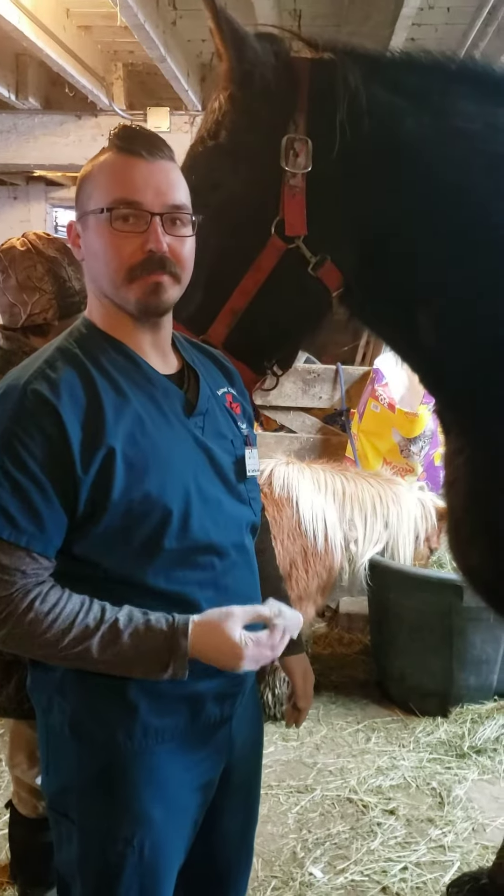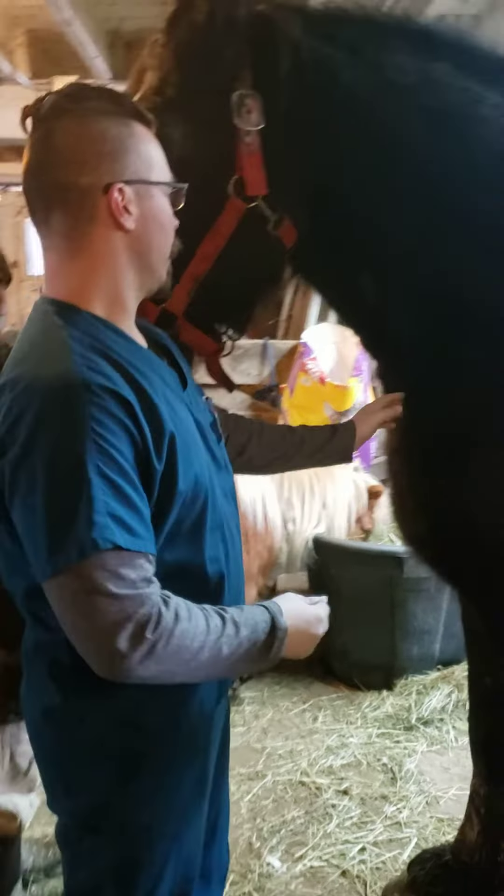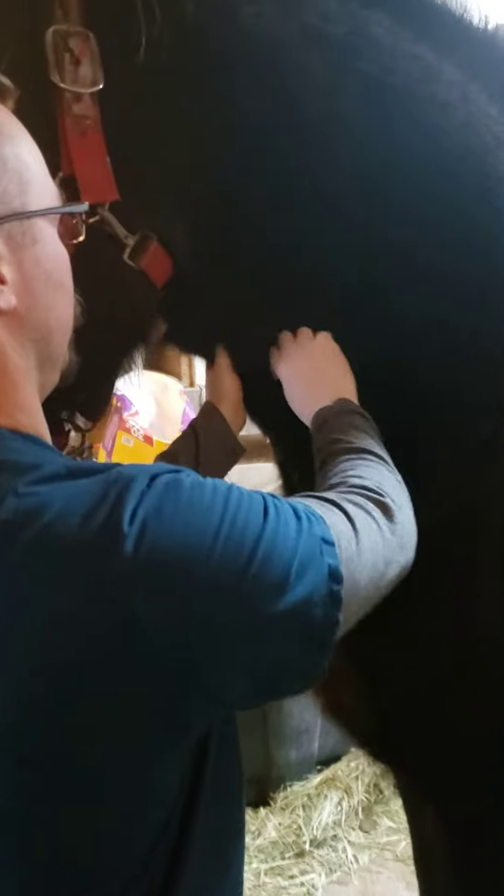Hi, my name is Michael Talley. In this video I'm going to be doing a venopuncture on a horse. I'm just going to start by scrubbing the insertion site here with a little bit of alcohol.